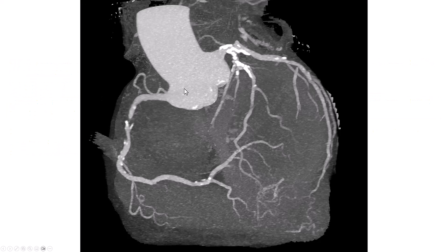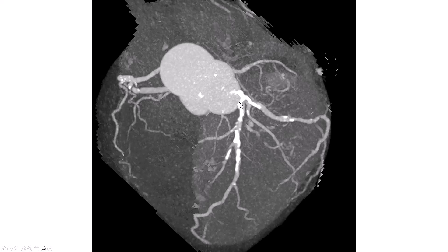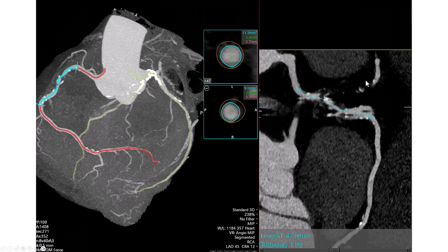This is the MIP, showing a focal lesion in the right coronary artery with some diffuse disease more proximally and some scattered calcification. There is more calcification in the left main and the LAD. This different projection again demonstrates severe calcification in the left system and focal calcium on the right.